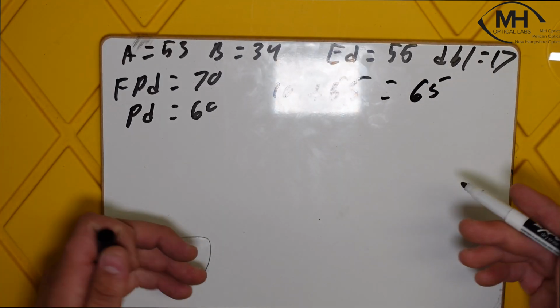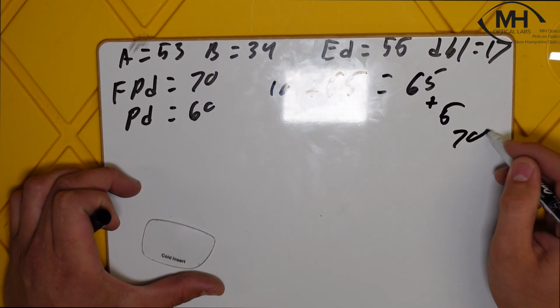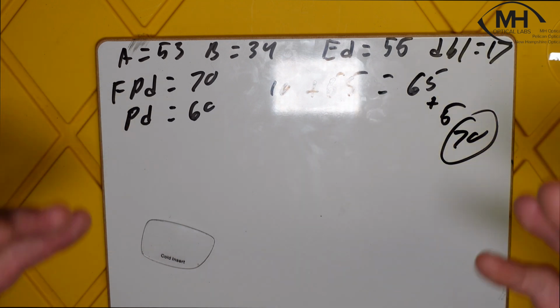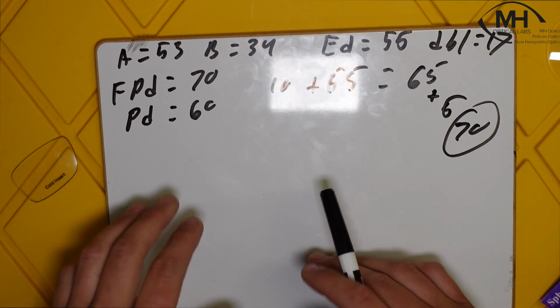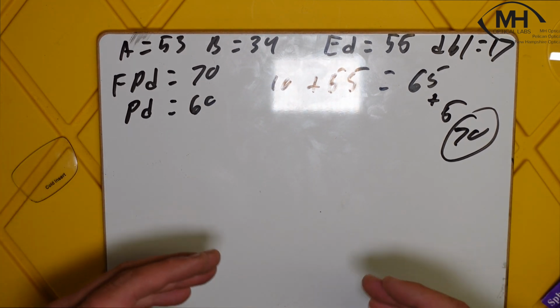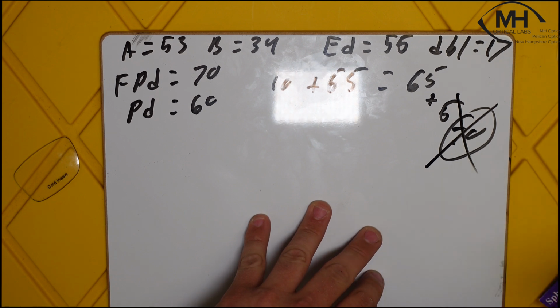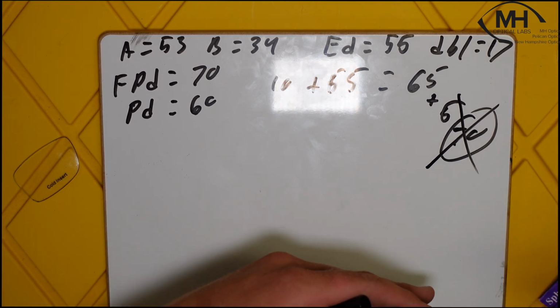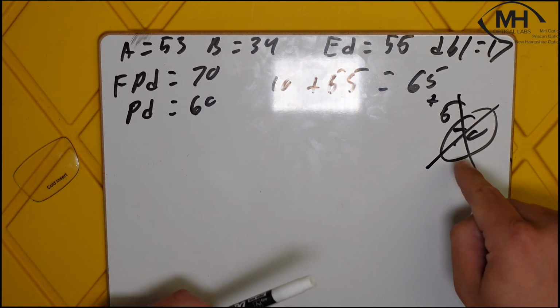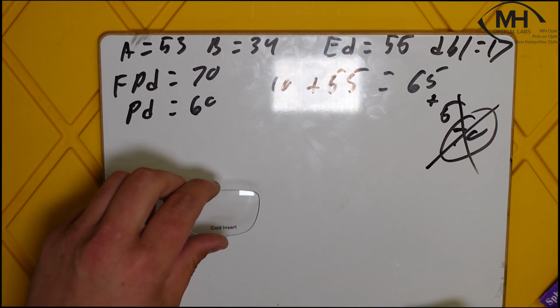Now, I usually give it an extra 5, to give us that 70 millimeter, just for a little flub room. So this number is great if you're looking for a stock lens, but it does not even translate to a surface lens. This is only for stock lenses, and I'll show you what I mean in a second.